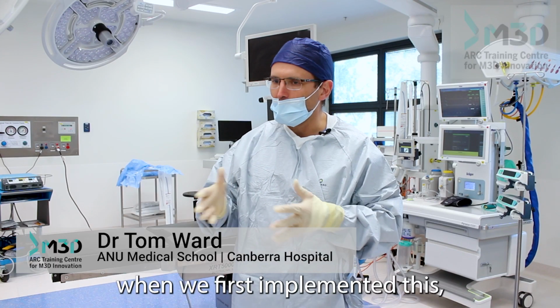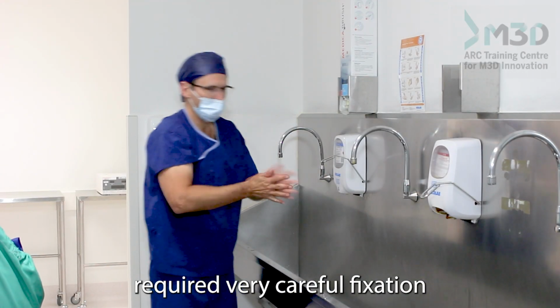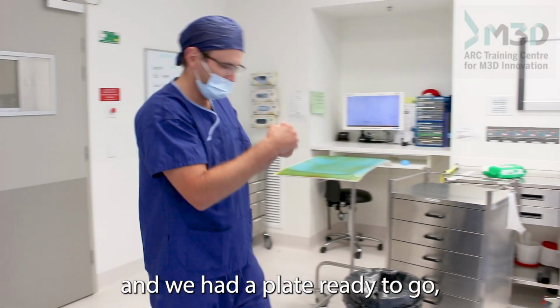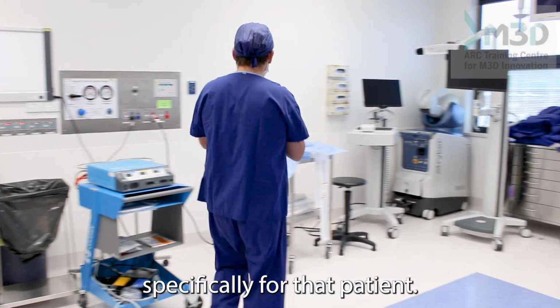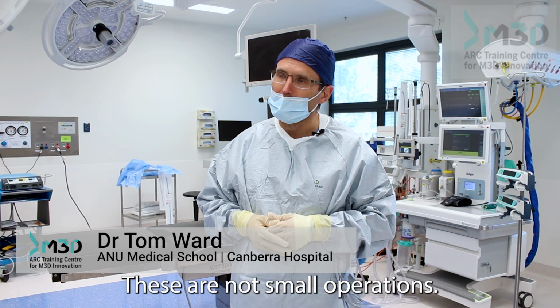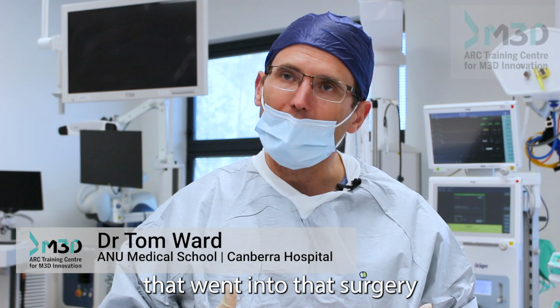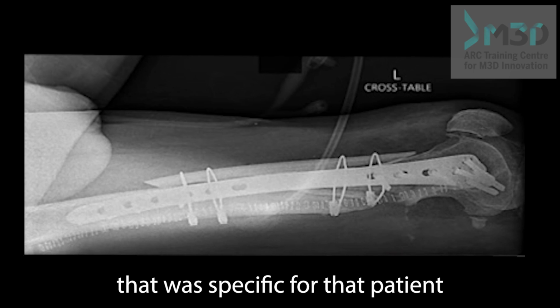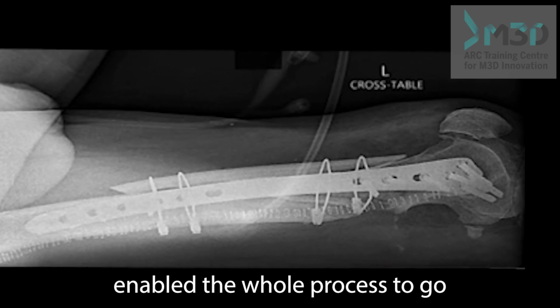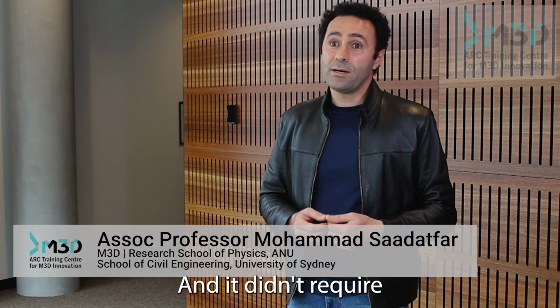The day when we first implemented this, we had a fracture that required very careful fixation, and we had a plate ready to go which was contoured specifically for that patient, and the surgery itself went smoothly. These are not small operations, they take hours, but having had the planning that went into that surgery and having had a plate that was specific for that patient enabled the whole process to go more smoothly than it normally would. And it didn't require any manipulation.